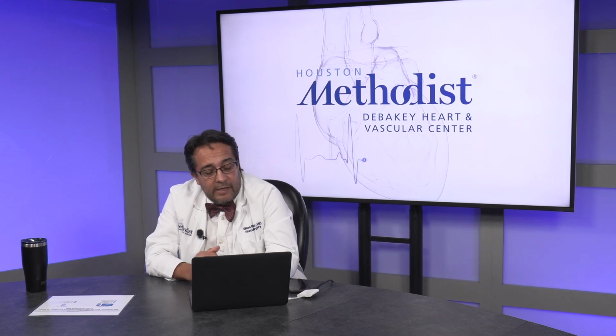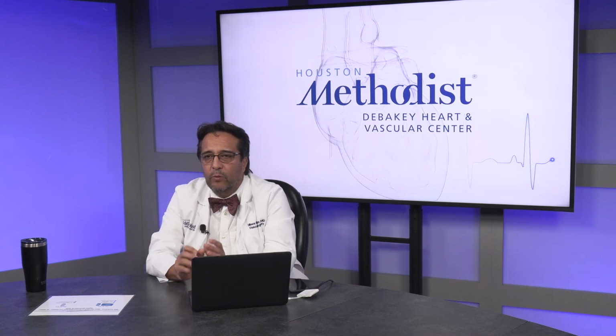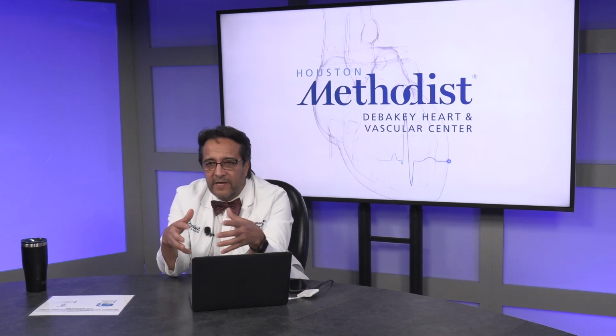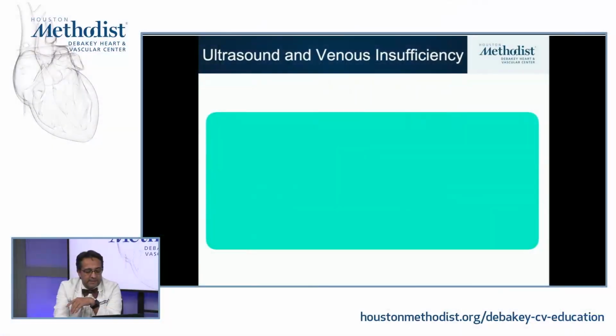So sound cannot travel in a vacuum, and whatever medium it's traveling through is going to influence the image that we are going to get in the machine. So when you combine sound and image, it's two different things. 1 + 1 is 2, duplex. Duplex ultrasound is when you have image and sound.